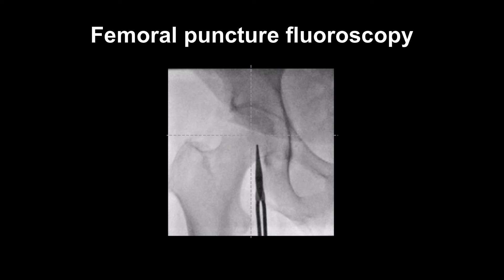In this frozen fluoroscopic image you can see localization of a good puncture site in action. The operator locates the best palpable pulse and, using surface anatomy with all the caveats mentioned, determines their preferred puncture site. They then mark where they intend to puncture by lying a metal object such as scissors or forceps on the patient and perform fluoroscopy. If, as in this case, the tip of the scissors — i.e. the assumed puncture site — lies over the medial femoral head, then you're good to go. If it does not, you need to reposition the marker so that it does lie over the femoral head radiographically, then use this marker to reorientate yourself on the patient and determine the best puncture site.